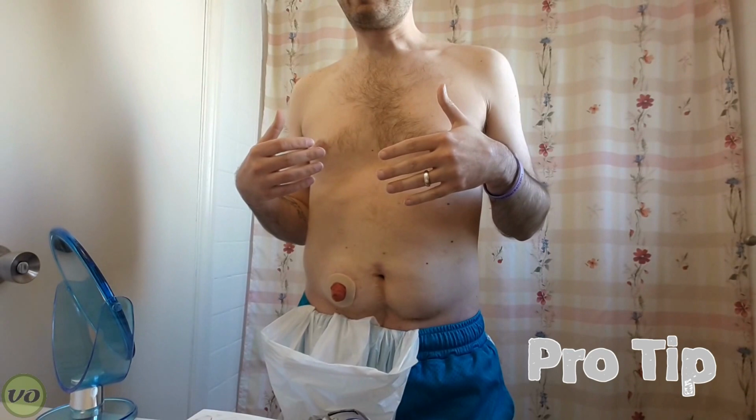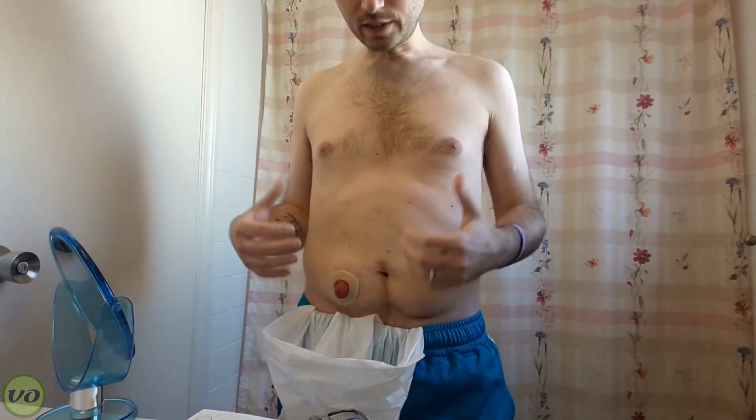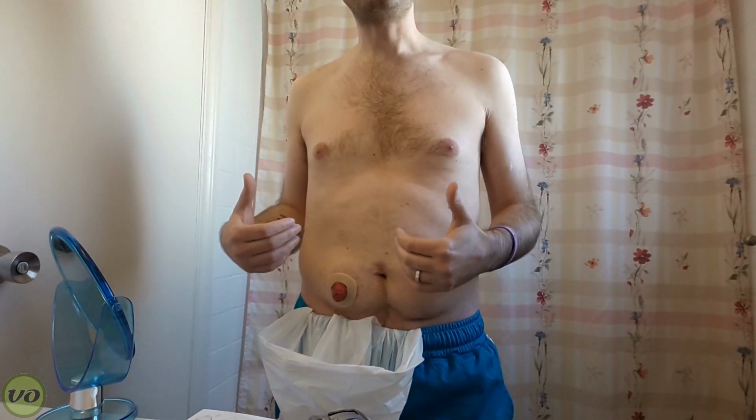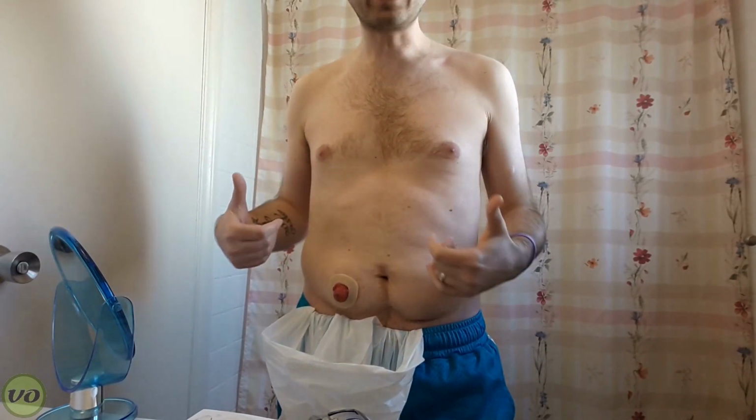Now this is a great way to prevent leaks. If you have very liquid output, or even loose output that tends to create leaks for you, this is going to be one of the first things that your stoma nurse will probably get you to do. And what it does is, as it gets wet, it will start to puff up and fill in any gaps so that no liquid can come through. It's a fantastic idea and really will save your skin if you're prone to those kinds of issues.